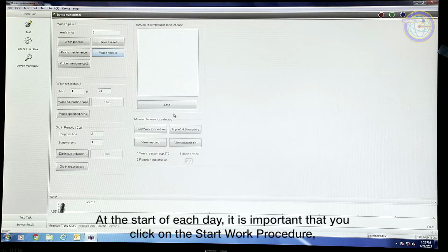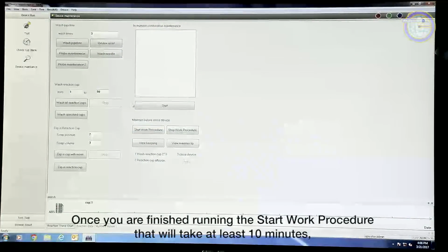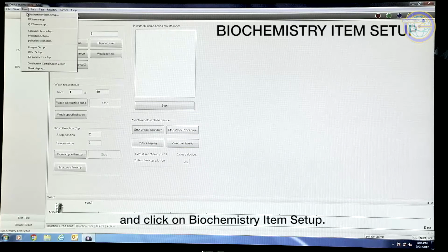At the start of each day, it is important that you click on the Start Work procedure so that it will run through calibration and cleaning of your instrument to prep for your work during that day. Once you're finished running the Start Work procedure that will take at least 10 minutes, go up and click on Item and click on Biochemistry Item Setup.